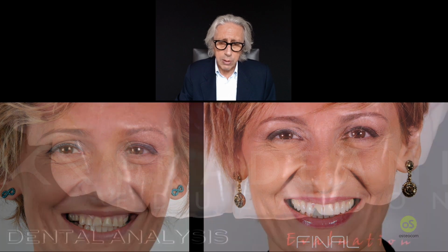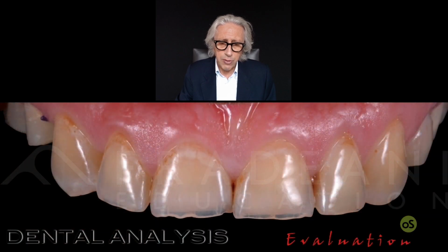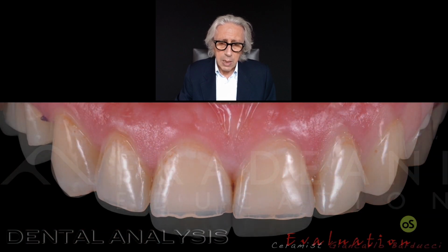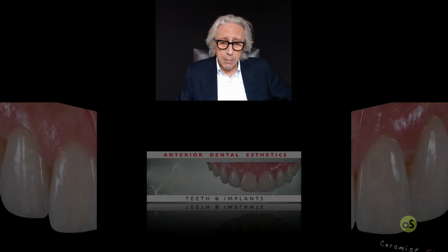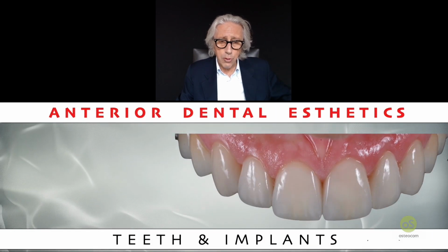And that's the final work that is made with the 6 anterior porcelain plus all the posterior areas still in ceramics. So we start with that, we finalize with this, and we achieve a satisfactory result for the patient. And I believe that is our goal. And again, the phonetics, even on anteriors, takes an important role.